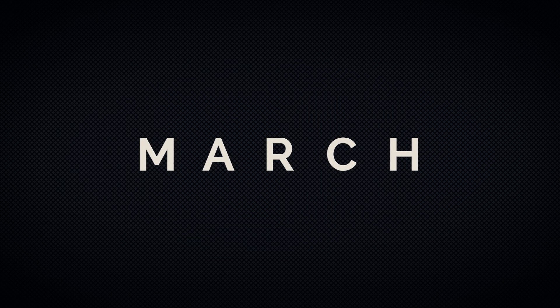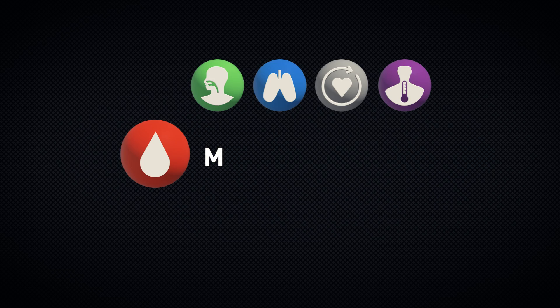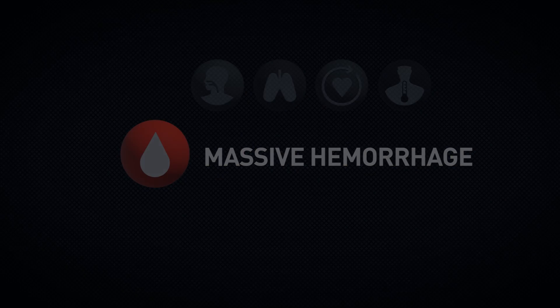During this video, we'll discuss the features of the TMT tourniquet and its proper use for treatment of life-threatening massive hemorrhage from an extremity.